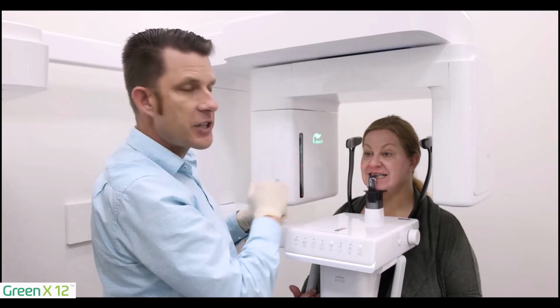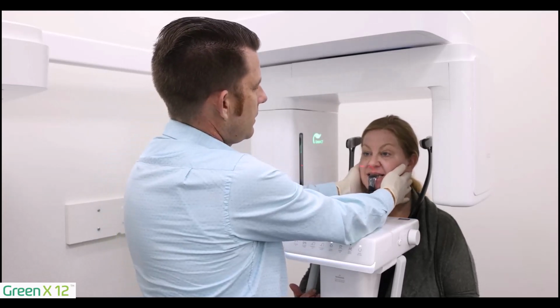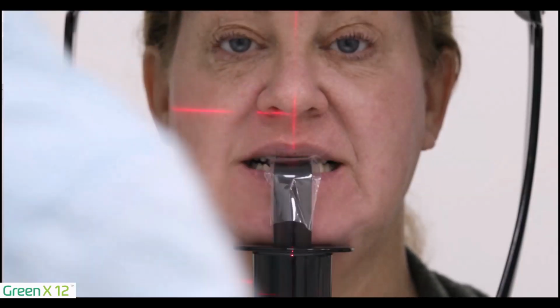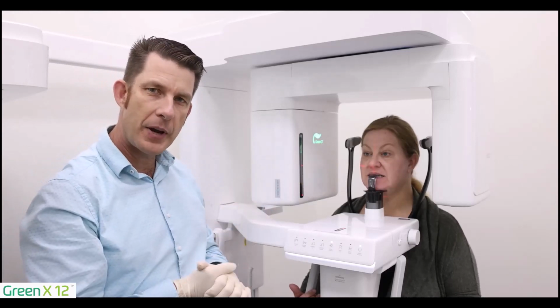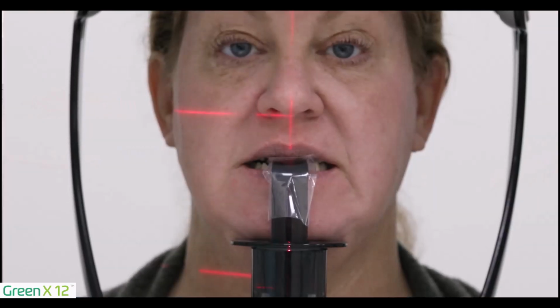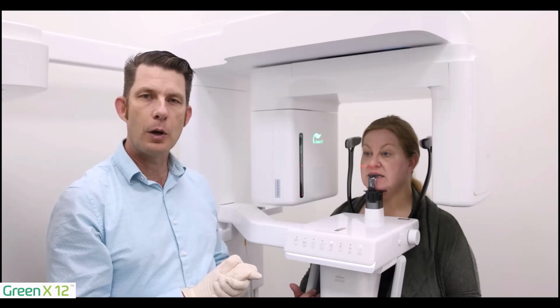Next, I'm going to make sure the patient is lined up center. I'm going to go ahead and get you lined up center here. Perfect. Chin's on the chin rest. Couple things to note. We have a horizontal beam shining on the right side of the patient's face. Depending on the field of view you've chosen, it depends where that horizontal beam will be located.